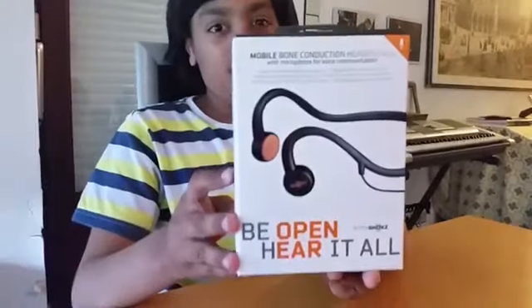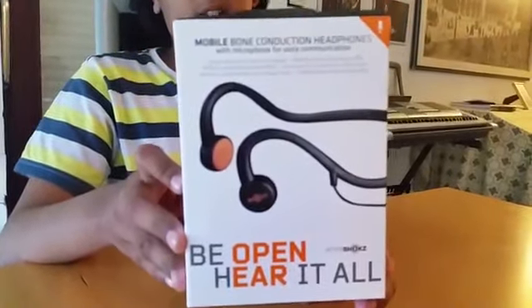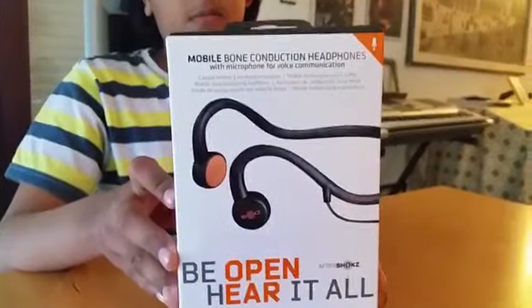Hi guys, today I'm really excited, and so is my dad. I got this — it finally arrived! This is a pair of bone conduction headphones. I was born with an ear condition called microtia and aural atresia. With the help of these AfterShokz headphones, I'm going to be able to hear real music through bone conduction. Now let's begin with the unboxing.